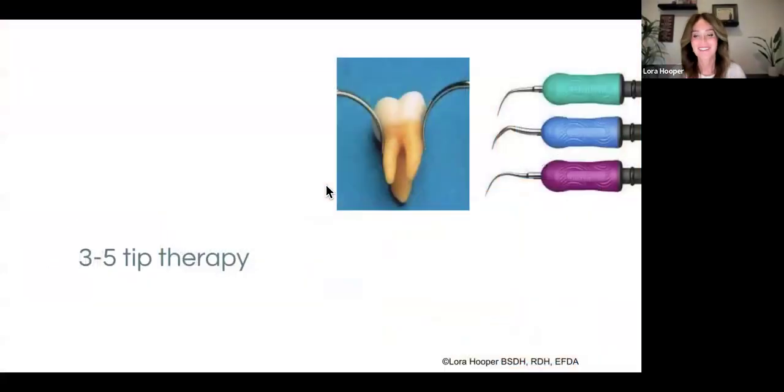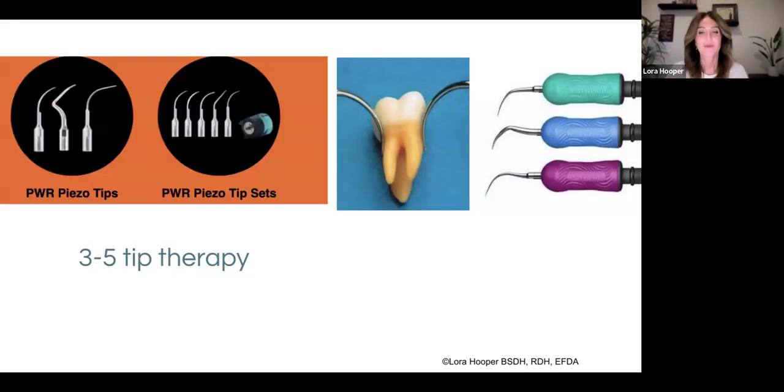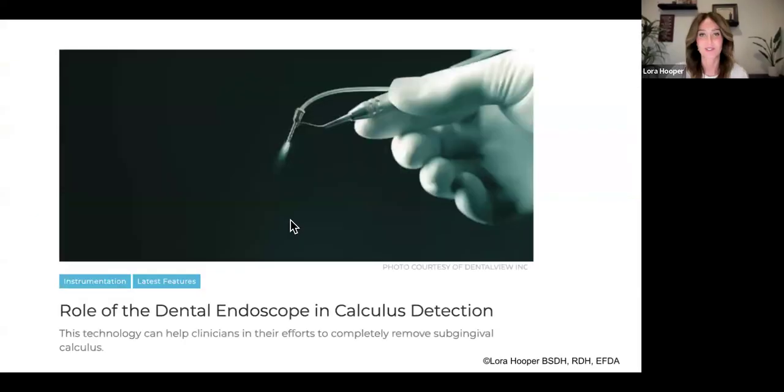And then if we don't have those things, don't fear, because 15 years ago, I didn't have those either. I've been a hygienist for 30 years. We can do good old cavitroning and piezo tips, but we do have to make sure that we're getting to the extracellular matrix. So we want to make sure that we're using repetitive therapy, multiple tips, many times on higher power, because we do have to break that up. So consider that, be looking at your tips. You can still do that.